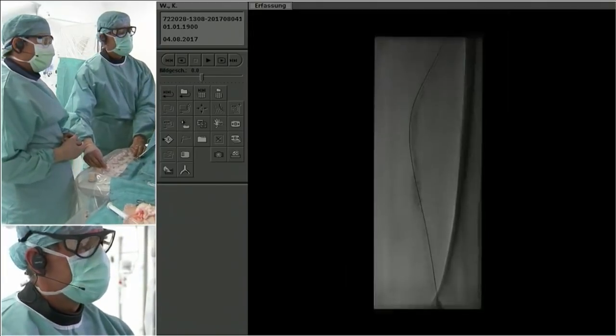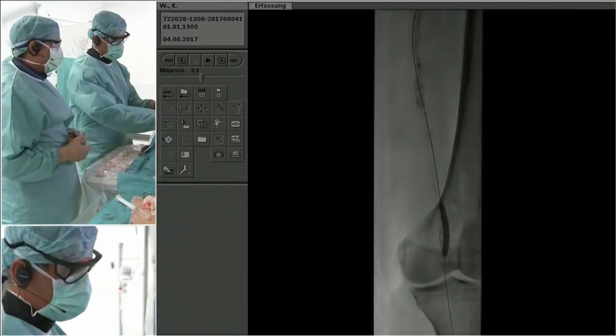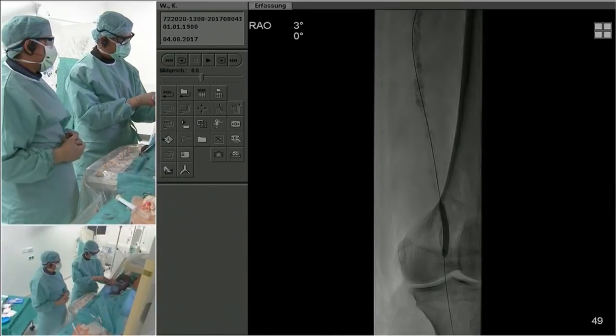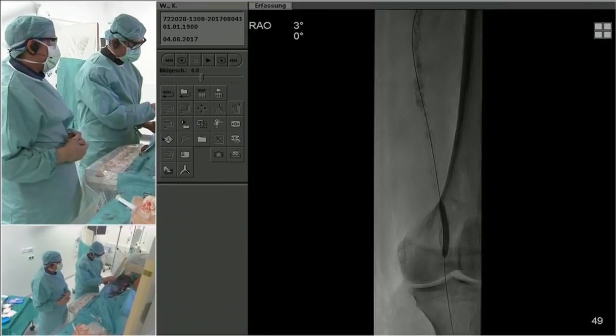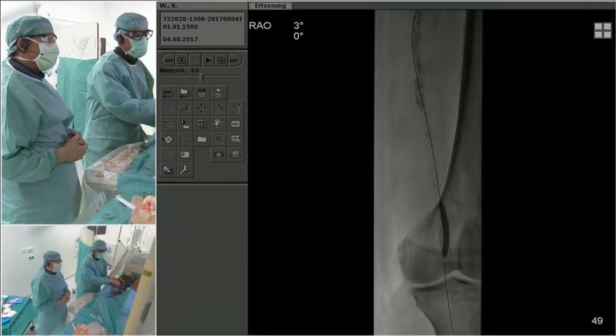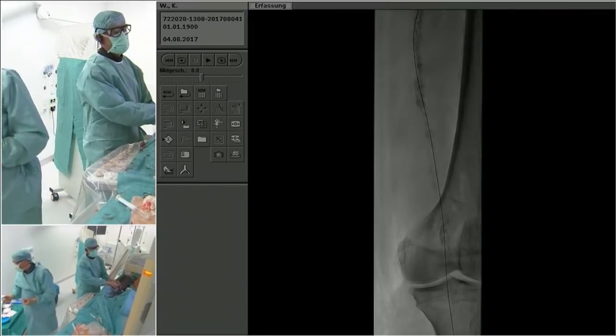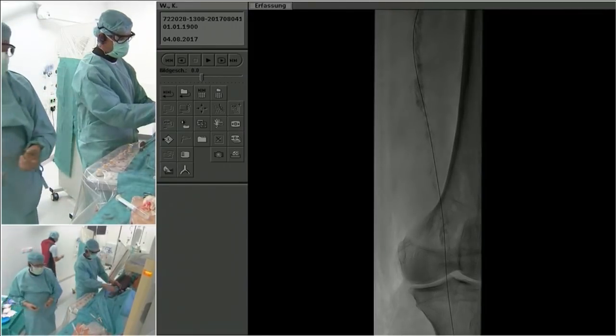So any takers for atherectomy here or straight with Viabahn? I don't think atherectomy here will do much good. I think here you have to just pave it with a Viabahn and then just crack it with a balloon, high pressure. Otherwise, you'll get poor expansion of your stent. Same approach? No, really, because he already dilated, there's no point of doing atherectomy.